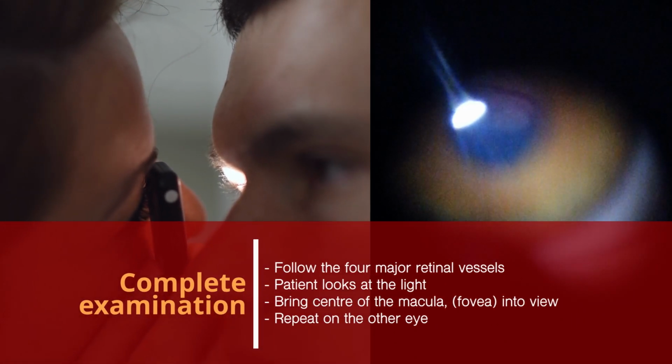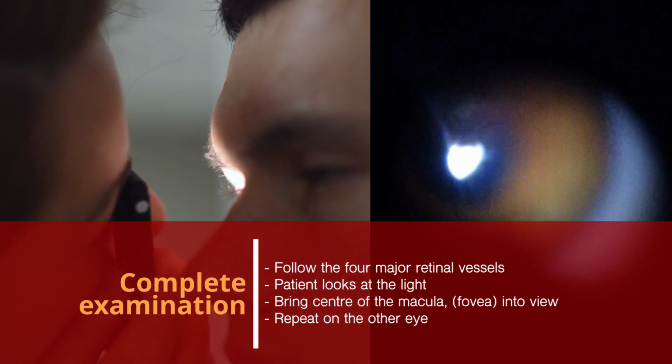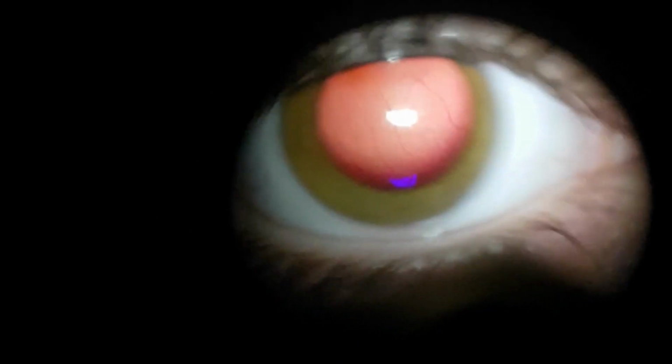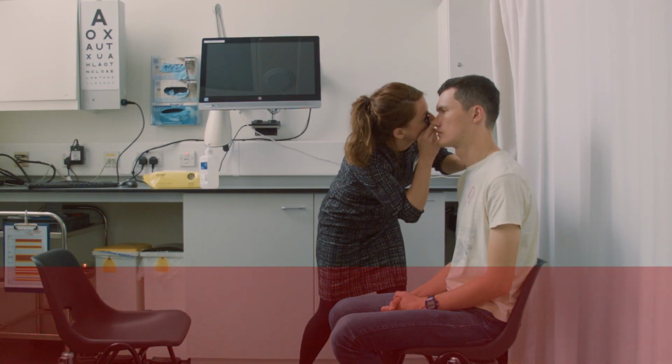Finish by asking the patient to look into the light to bring the centre of the macula, called the fovea, into view. In a non-dilated eye, this will cause the pupil to constrict and you will lose the view. In a dilated pupil, the fovea can be seen as a slightly darker zone with a pinpoint reflection. Repeat this examination on the other eye.